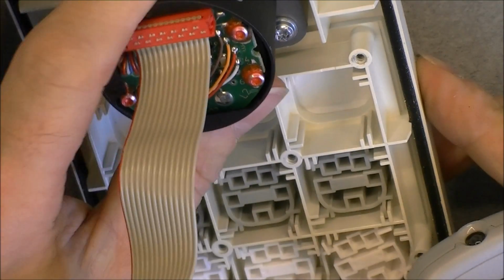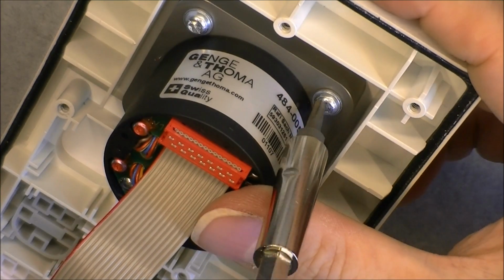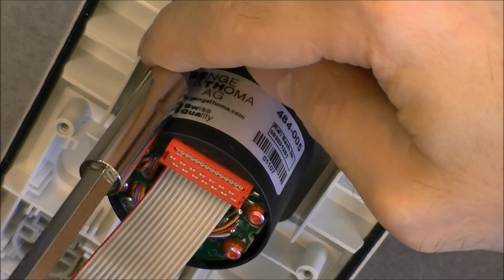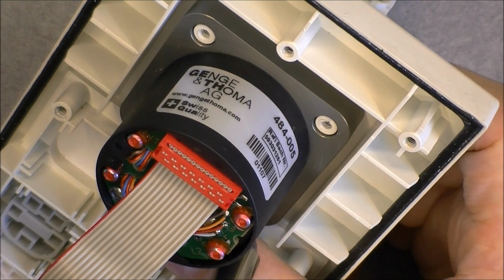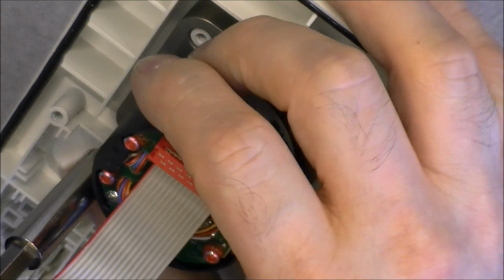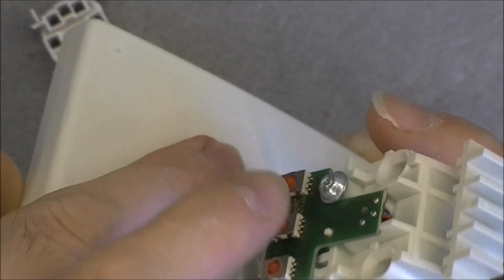Here we have a little interface or something, so I will try to remove this and we will see if there is anything more to see. It is a lot of parts on my bench already. So I guess in the one I have where the joystick is loose, probably this standoff did break from the cover. Seems to be a very expensive part for sure, this one. So I might be able to route it through the hole here, yes.